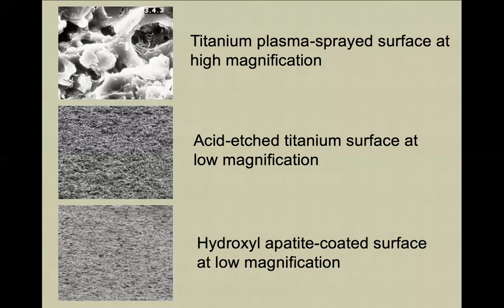Now, if you're planning to unscrew a dental implant, believe me, a successful implant that is integrated with the bone is very difficult to unscrew. It is nearly impossible. For that, we use special devices that will cut out the dental implant and the surrounding bone.